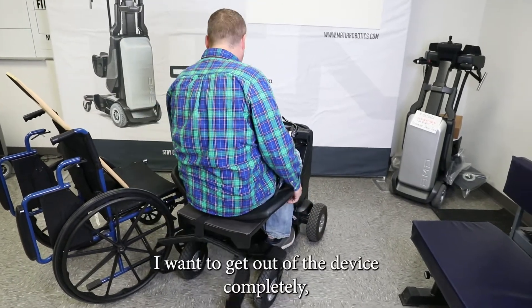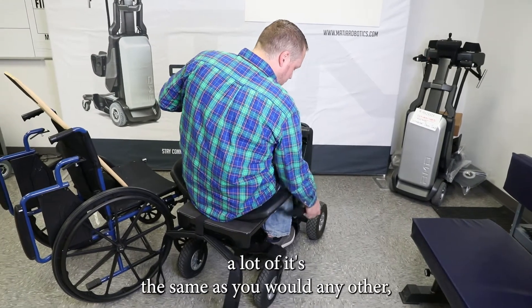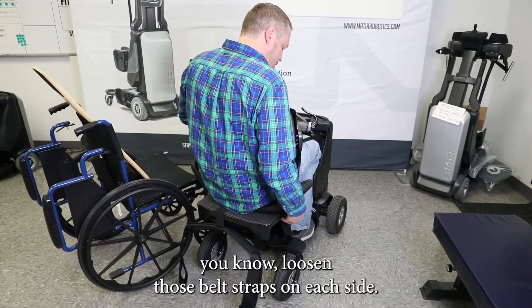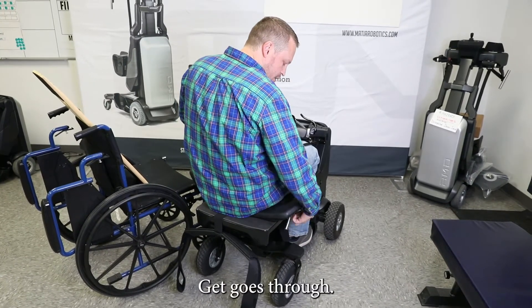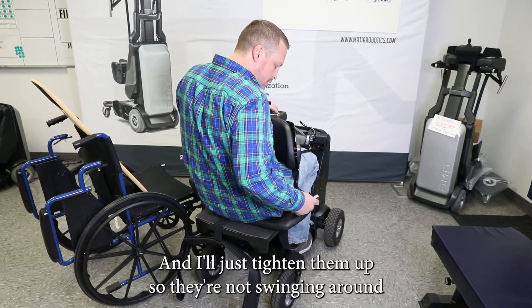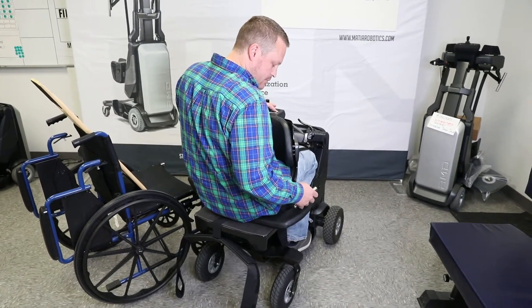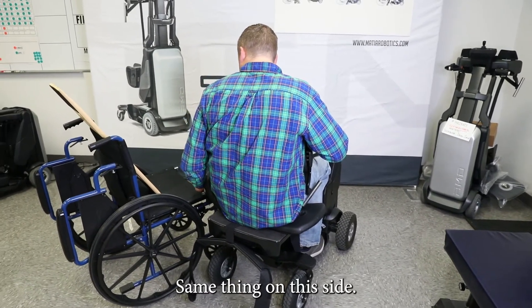If I want to get out of the device completely, a lot of it's the same as you would with any other. I'm going to loosen those belt straps on each side, get those through, and I'll just tighten them up so they're not swinging around. Same thing on this side.